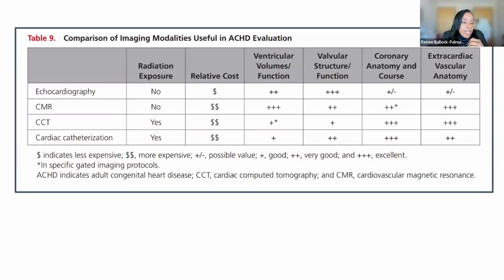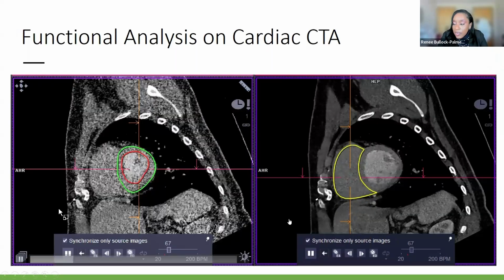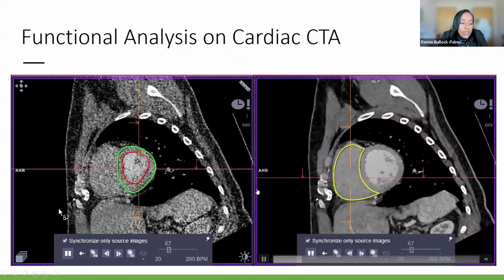And really communicating this with the cardiac catheterization interventionalist, and ideally, if someone is more like here at our institution, an ACHD interventionalist, is the person that we go to in terms of doing these catheterization procedures, because they do take time, and you want to make sure that you're getting the information that you need from these patients, from the study.